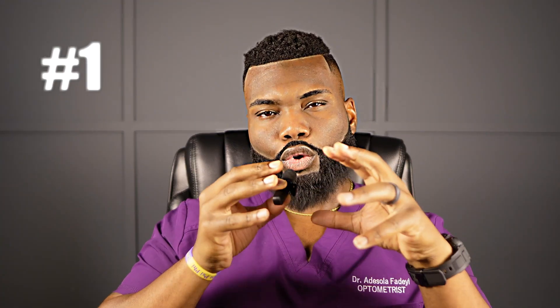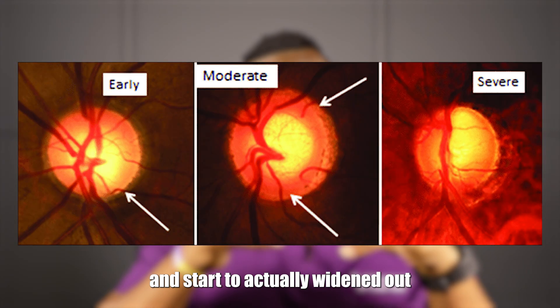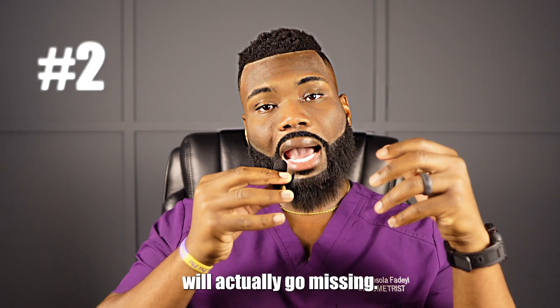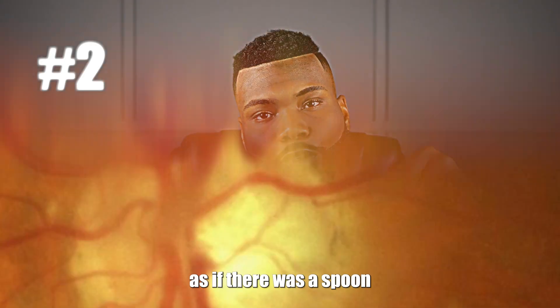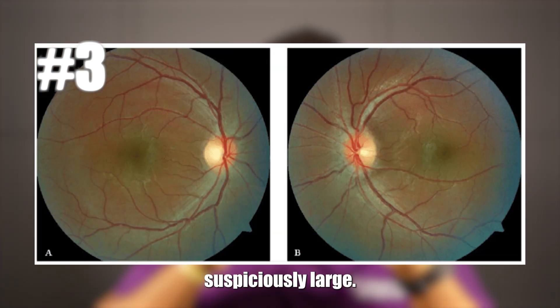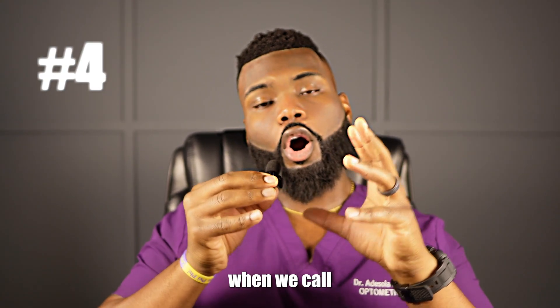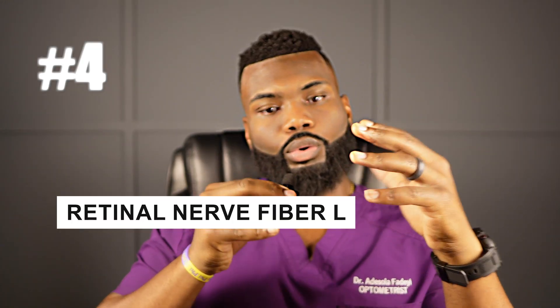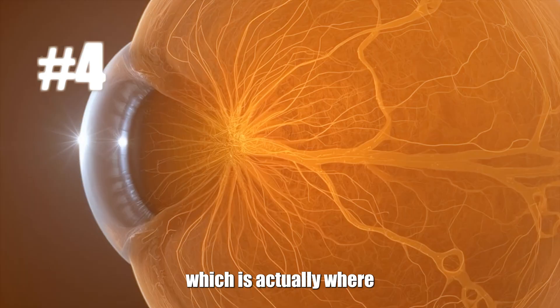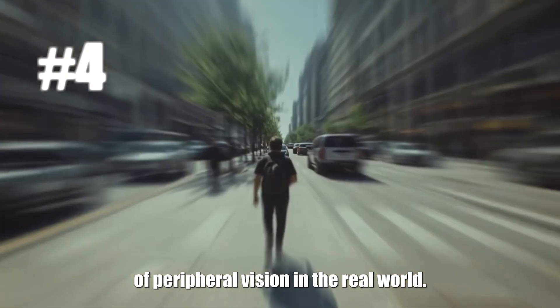The first way it damages is neural rim thinning — the rim around the disc will start to thin, which gives the appearance of and actually widens out the cup. The second way we see damage is notching, where a focal area of the cup will actually go missing — it'll look as if a spoon scooped out from the cup itself. The third way is asymmetry, where one eye is perfectly normal but the other eye is suspiciously large. The fourth way is RNFL loss — retinal nerve fiber layer loss or thinning — where we'll see a loss of tissue in the space around the nerve, which translates to a loss of peripheral vision in the real world.